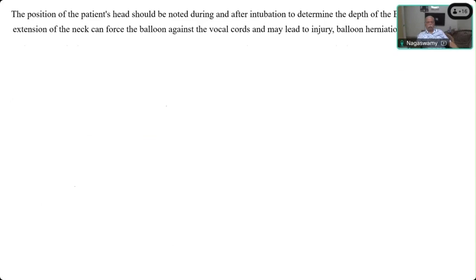So you have to mark the length of the tube, especially when you do oral cancer surgeries. What I do is, after I confirm the placement correctly, I take a marker pen and mark it on the tube itself before fixing the tube. I'd say it is 26 centimeters, 27 or 27.5, whatever the length. You make a mark with the marker pen, so that you will know whether the tube is migrating inward or coming out. So it should be correctly at the nostril level. This is an important point whenever the surgical manipulation requires movement of the head and neck.